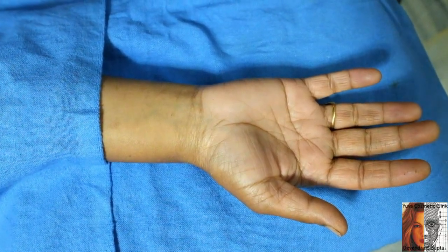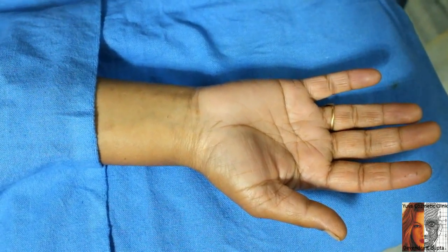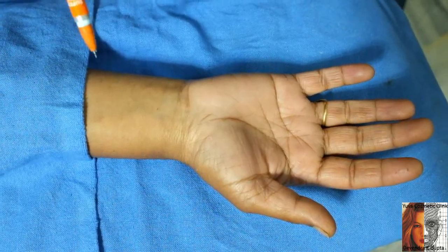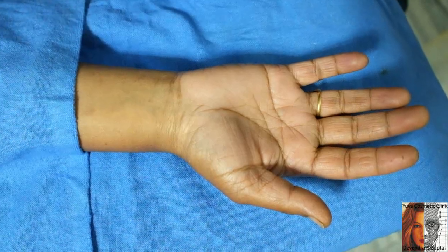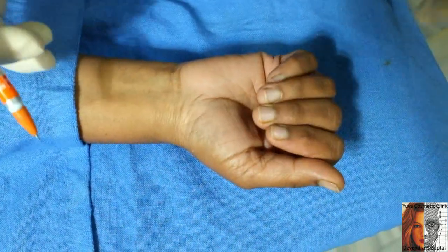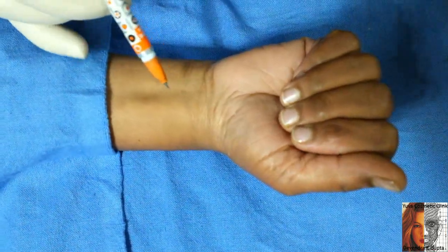This is a case of carpal tunnel syndrome and the symptoms are for last two years. I am planning to give a steroid injection for the relief of symptoms. You can see two important landmarks: this is the flexor carpi radialis and this is the palmaris longus tendon.